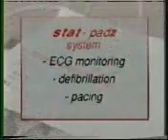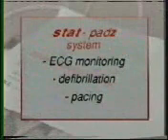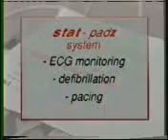Roll the stat pads onto the patient's skin from one side to the other to eliminate air pockets and assure good contact. The whole surface of the stat pads is covered with an adhesive gel, so the pad will adhere completely. But the gel also allows the stat pads to be picked up and repositioned if necessary. With the stat pad system, 3 functions can be performed: ECG monitoring, defibrillation, and pacing if needed. However, there are conditions which must be considered when using the pads.